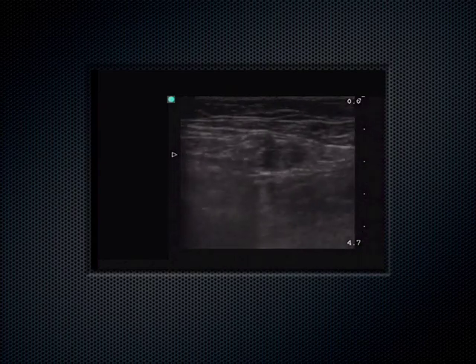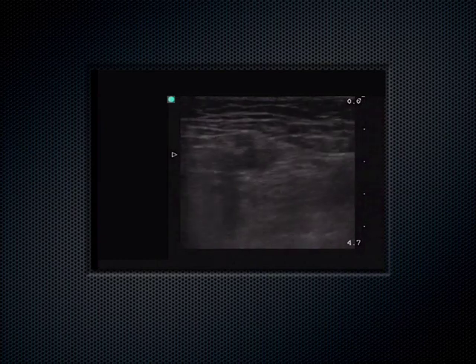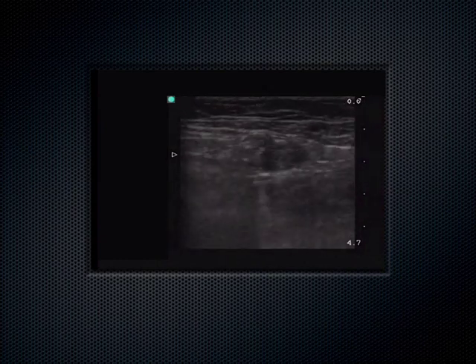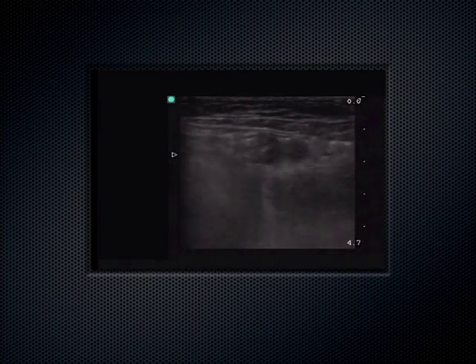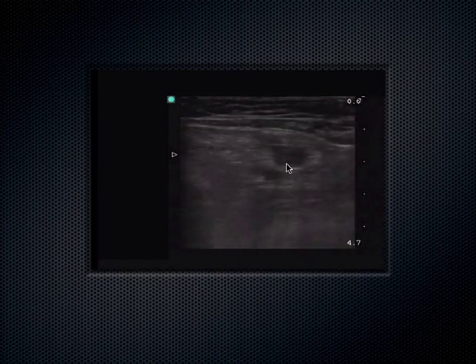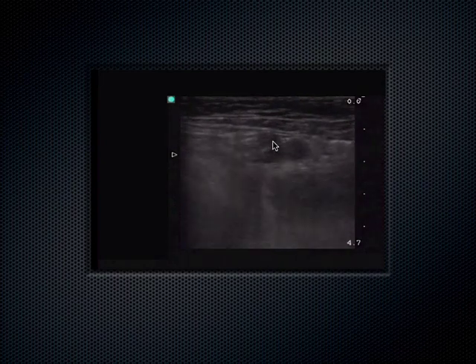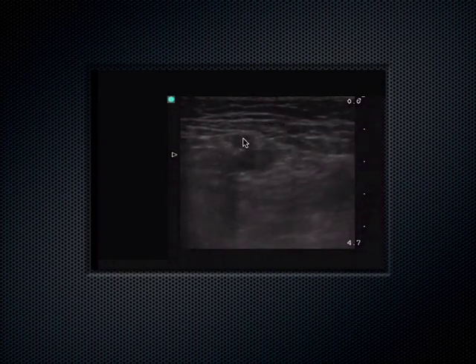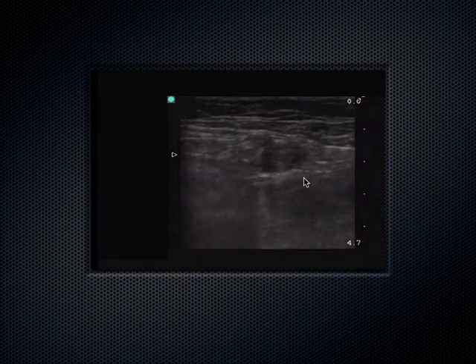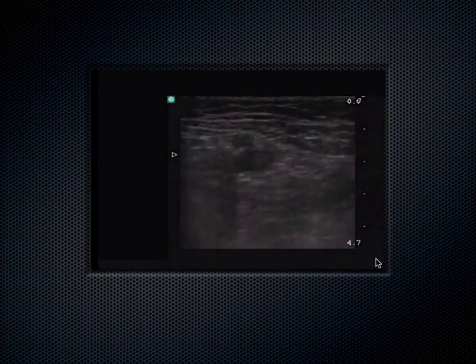They're cool. So this is a little old lady that came in complaining of leg swelling. What do we see here? Not compressible. So there's DVT where? Right leg. So this is the femoral artery up here. She's a little tiny thing. This is her femoral artery up here, and this is her femoral vein right here. And once in a while, boom, it's not compressible right there. Now, technique-wise, yeah, definitely.